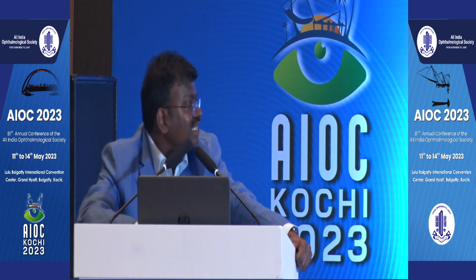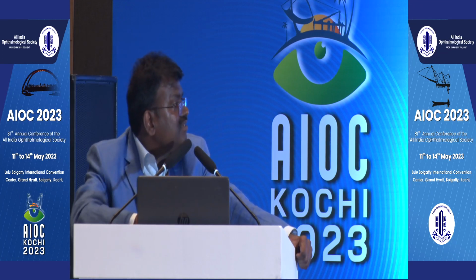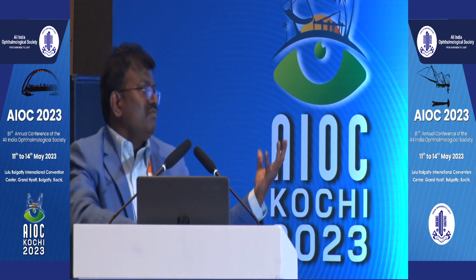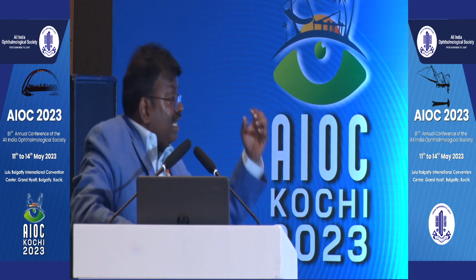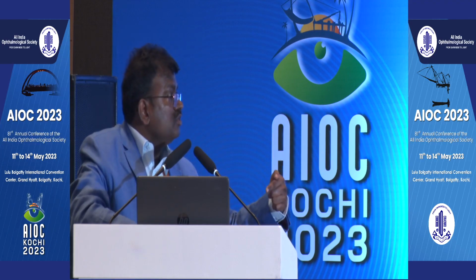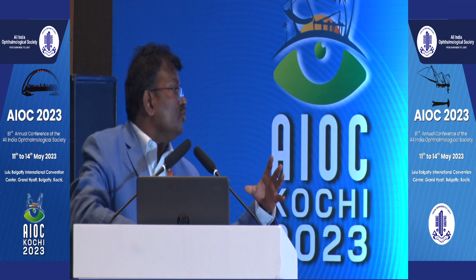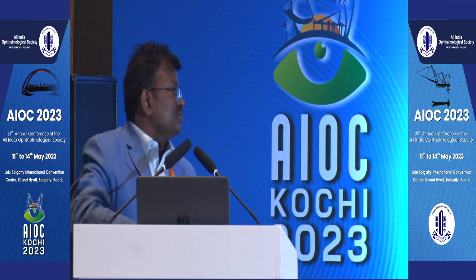As I have told, don't do much vitrectomy. In fact, nowadays I don't do vitrectomy at all. First, tackle the membrane, and do the vitrectomy only if the vitreous is not allowing the retina to settle. And in case the retina is shallow, we can do one more thing: make the port, and through the port infuse the fluid so that the retina becomes much more bullous, and then you go and approach the membrane.